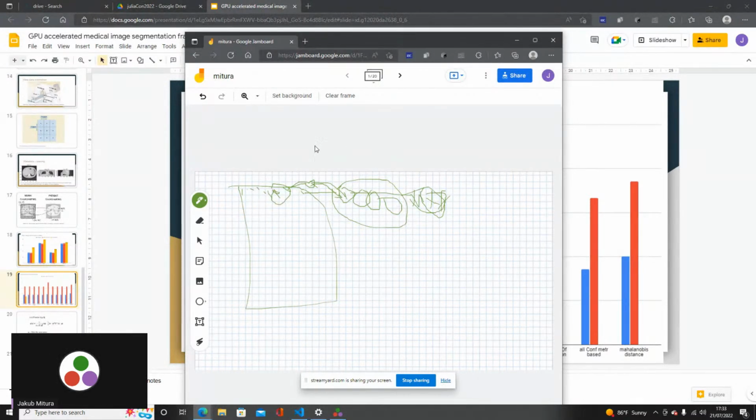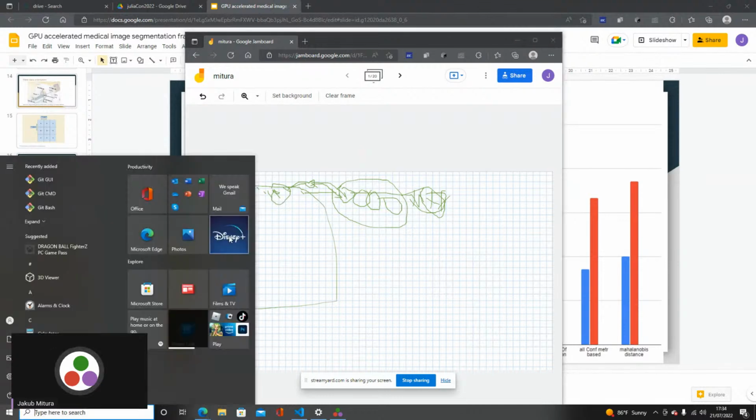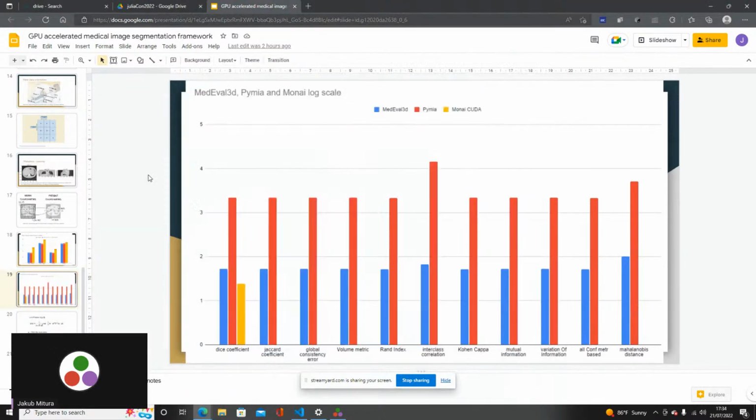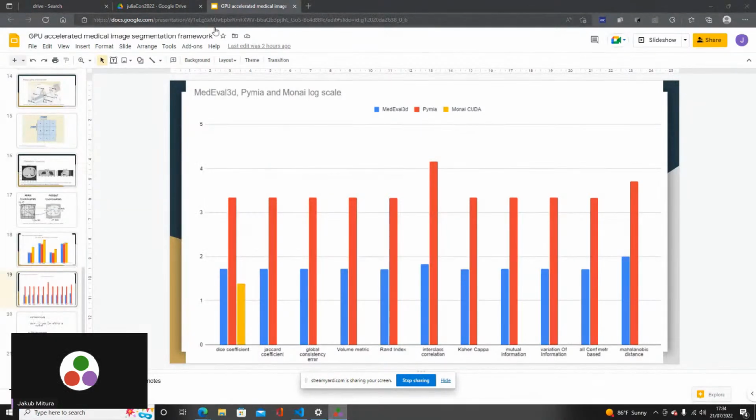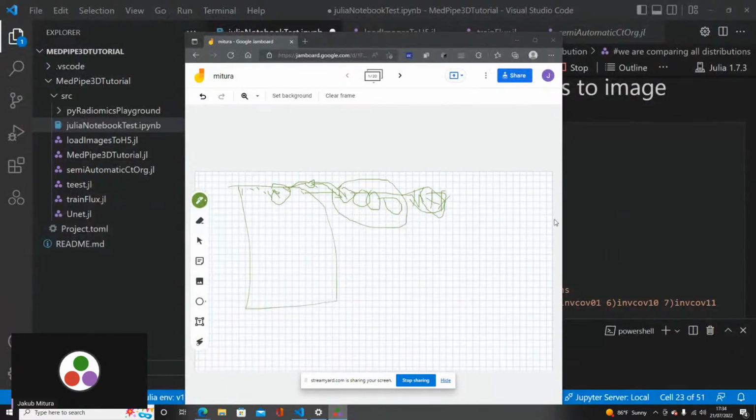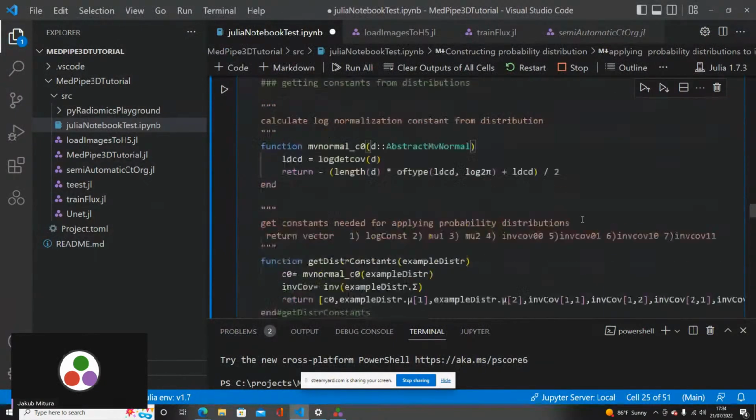Relatively simple, but a lot of them. If you would do it without any parallelization, it could take something like half an hour easily, maybe even more. But we can do this parallelization, and how to achieve this.